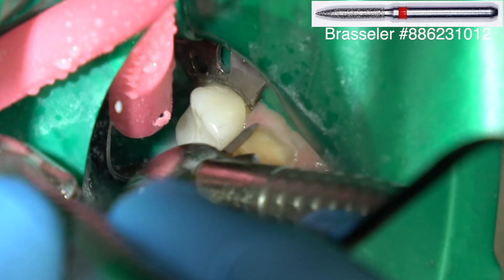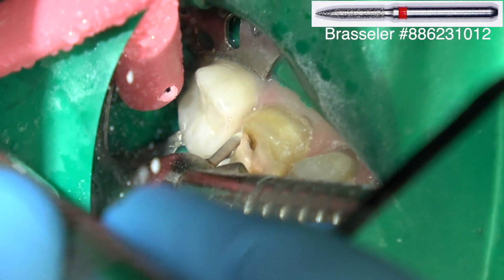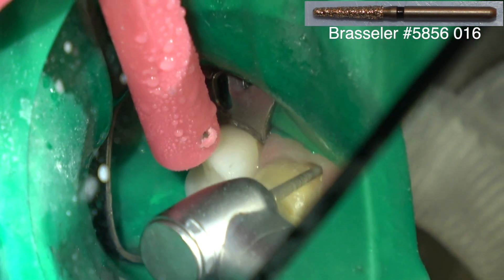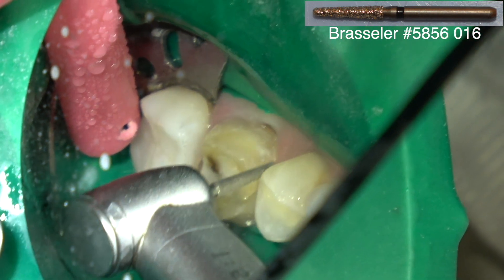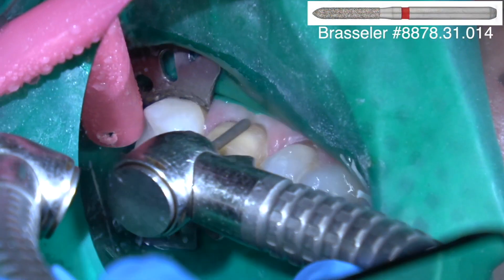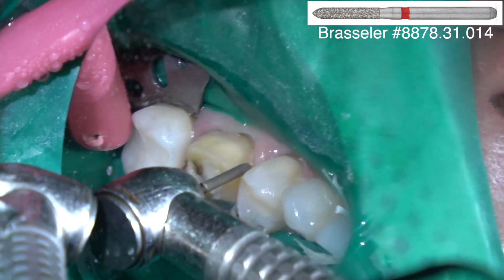I'm trying not to go subgingival interproximally if I can help it. This is a coarse barrel diamond, just barely subgingival on the facial. There's no reason to go subgingival most of the time on the palate. And this is a fine small chamfer diamond for the margin.